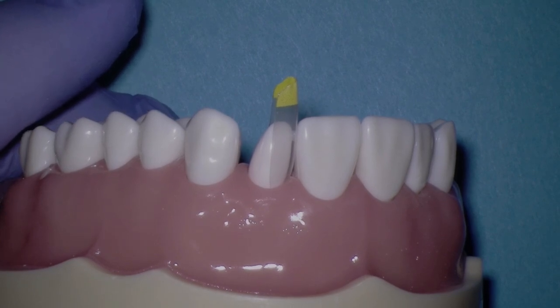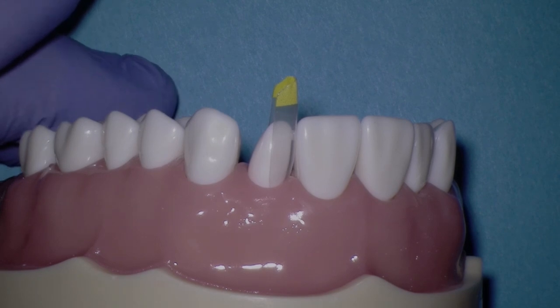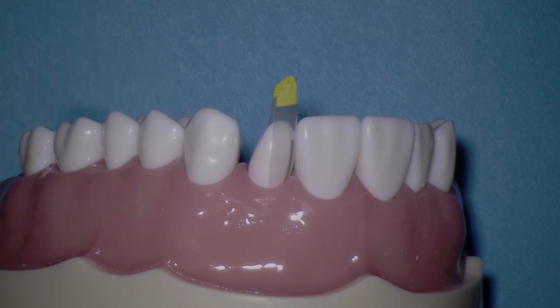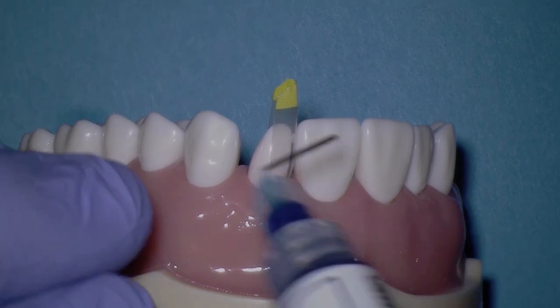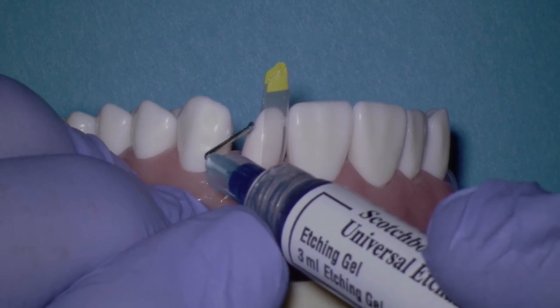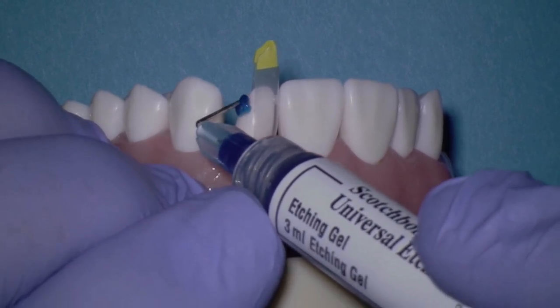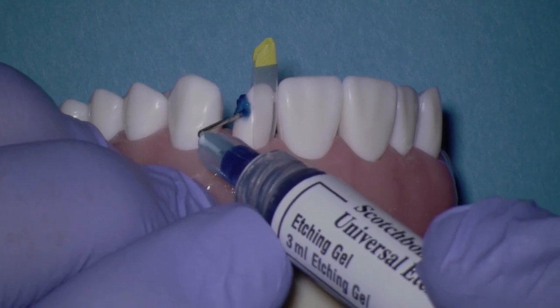Also, because it is a large space, we will probably have to create the direct contact strut in 2 steps and essentially build a bridge between the teeth for this very large diastema. So we'll be following about the same sequence that we did on the mesial. We'll come in and acid etch an area about twice as big as the area that we'll need for the actual adhesive in the direct contact strut.